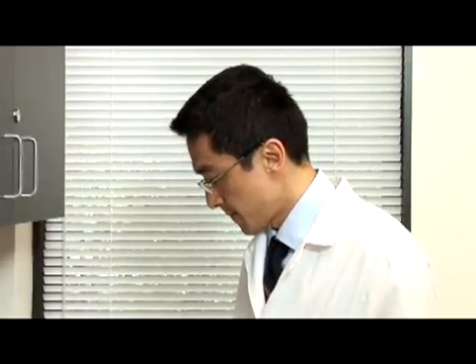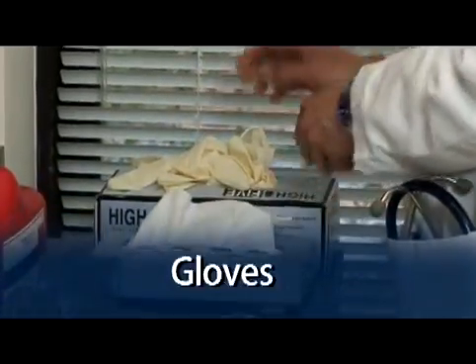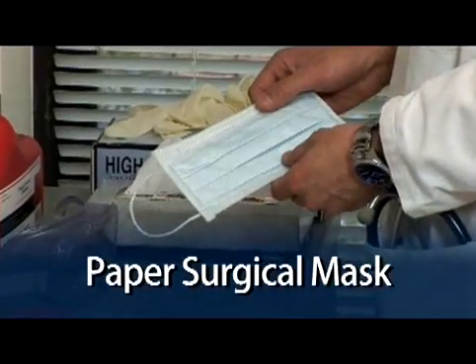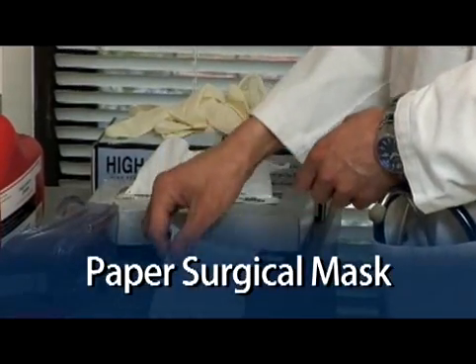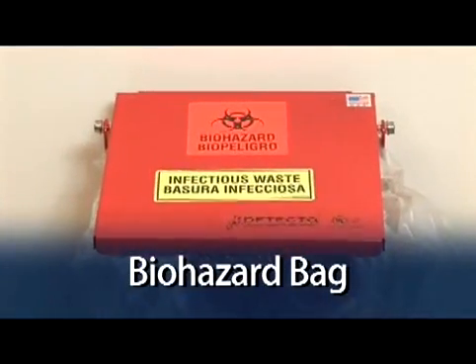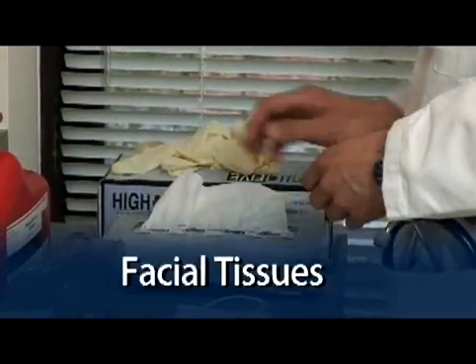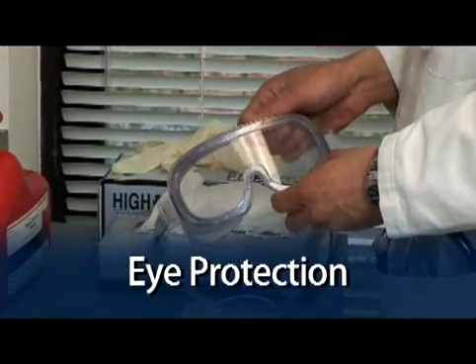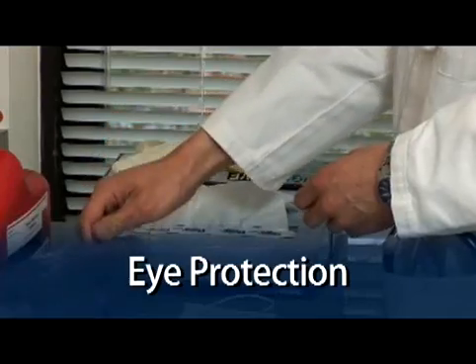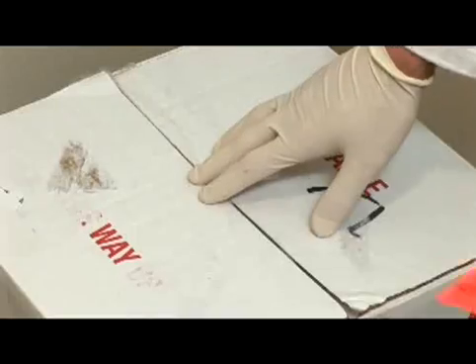Before performing the procedure, make sure you have the following materials on hand: gloves, a paper surgical mask for covering your nose and mouth — there is no need for an N95 mask — a biohazard bag for disposal of used tubing, facial tissues for patient use, eye protection to protect you from coughs, sneezes or splashes, and a shipping container with cold packs and a biohazard label.